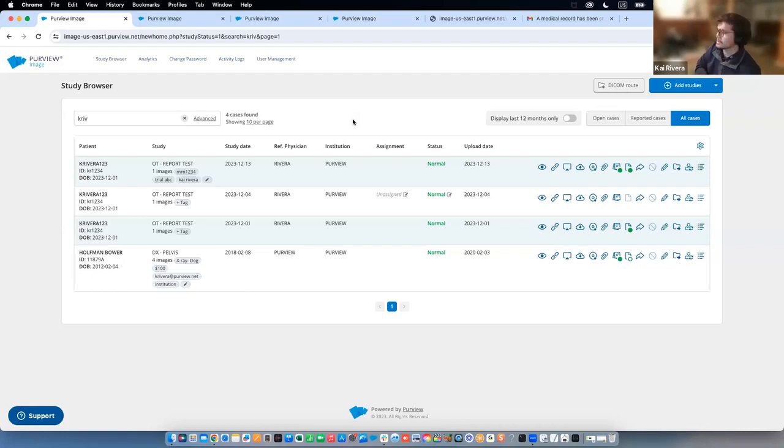And what we found is that users who have to handle radiology images in some way, right? They can benefit from having a cloud storage like Purview. Now, if you're comfortable with just leaving your scans on Horos or some other viewer, that's fine. But as your storage on your computer starts to fill up, then the performance of the machine goes down. There's also risk of losing those medical records if your computer breaks or if there's a natural disaster. We've had clients that have had entire basement levels of buildings flood, and that's where their documents and servers were.